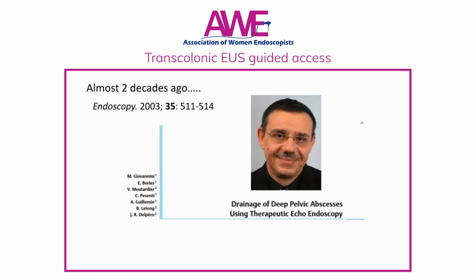Almost 20 years ago, back in 2003, this is Mark Giovannini, one of the pioneers of EUS, who described the first transrectal drainage of deep pelvic abscesses.